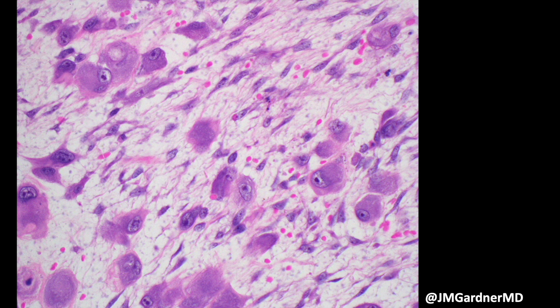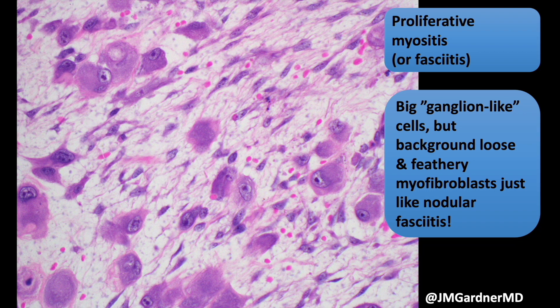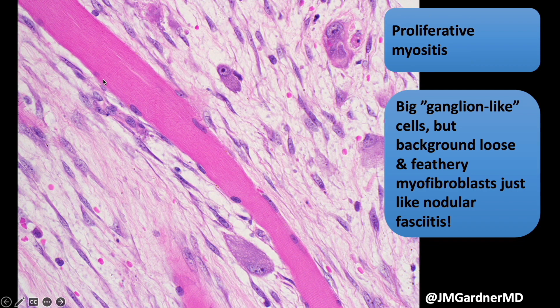Finding scattered ganglion-like cells in a background that looks like nodular fasciitis is really reassuring of a benign diagnosis — because otherwise these cells look really scary and weird. Even though they're big and atypical, they're not hyperchromatic; they still have that open chromatin. The background changes are everything, and of course the clinical context must make sense. In children with proliferative myositis or fasciitis it can be quite cellular with closely packed ganglion-like cells — those cases I still approach with great trepidation and anxiety.